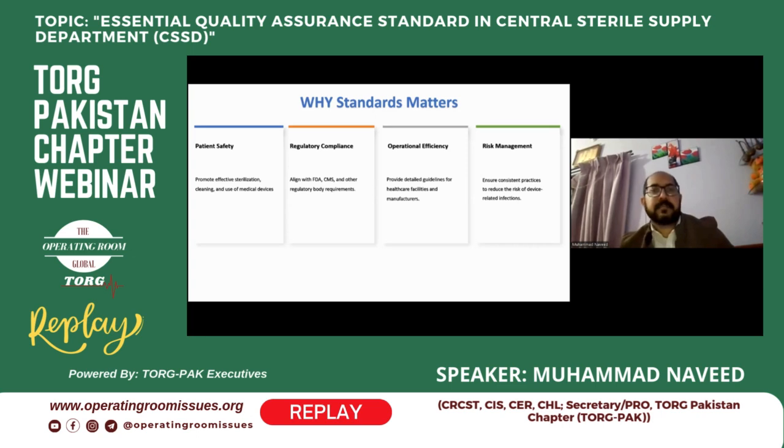Why do standards matter? There are four reasons. First is patient safety. Second is regulatory compliance. Third is operational efficiency. Fourth is risk management. Patient safety: promoting effective sterilization, cleaning, and use of medical devices.